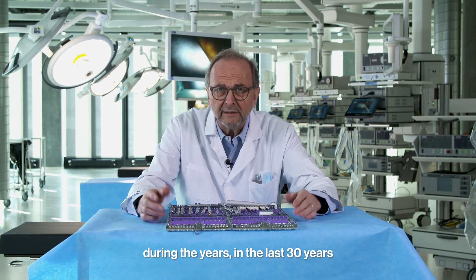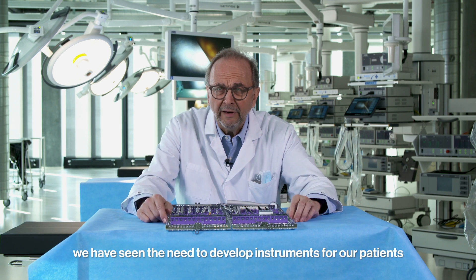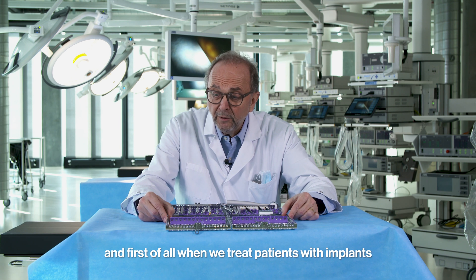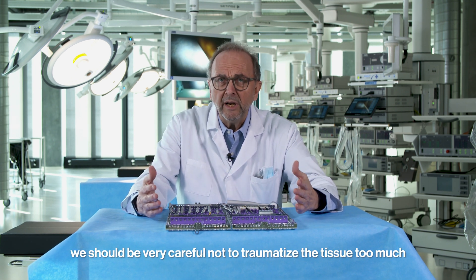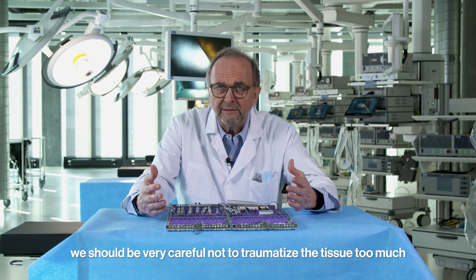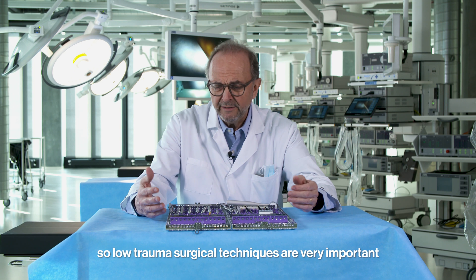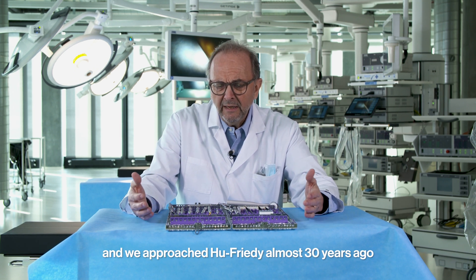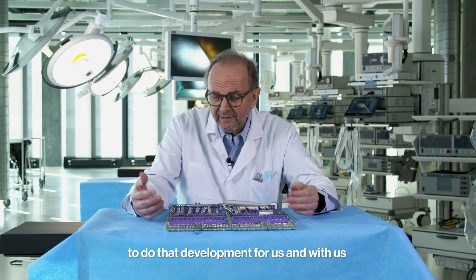During the years, in the last 30 years, we have seen the need to develop instruments for our patients. When we treat patients with implants, we should be very careful not to traumatize the tissue too much. Low-trauma surgical techniques are very important, and we approached Hoofriti almost 30 years ago to do that development with us.